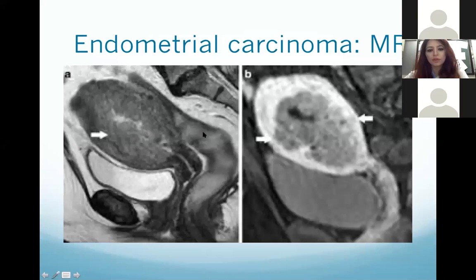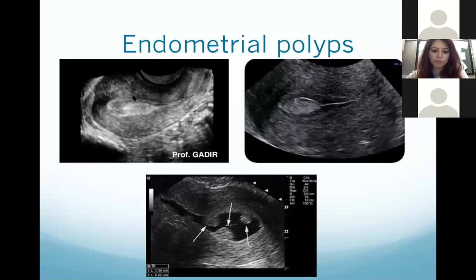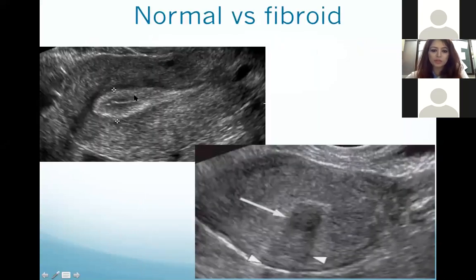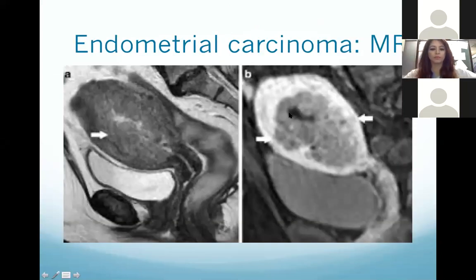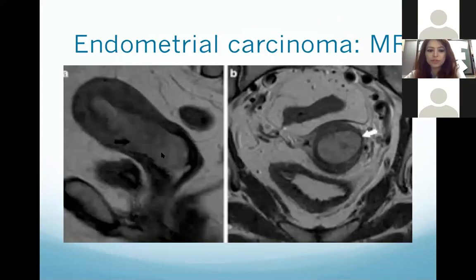This is a case of endometrial carcinoma. You can see a large mass with irregular margins within the endometrial canal infiltrating into the surrounding myometrium. Here you can see the normal endometrium for comparison, and in endometrial carcinoma there is a large bulky mass projecting into the myometrium. This other large bulky mass is infiltrating into the surrounding myometrium as well as into the cervix.